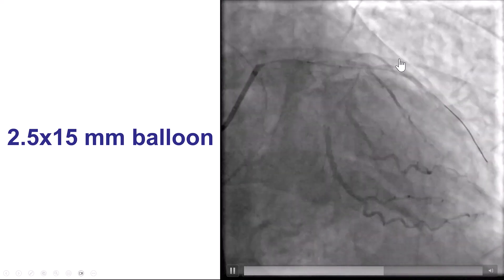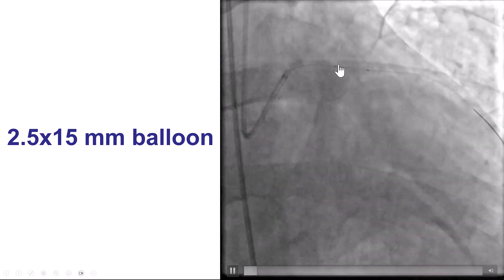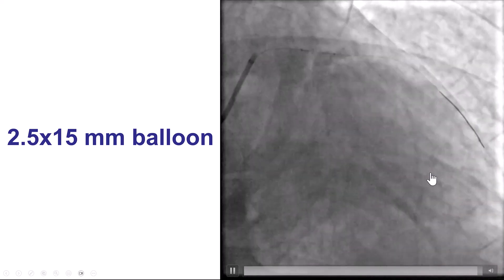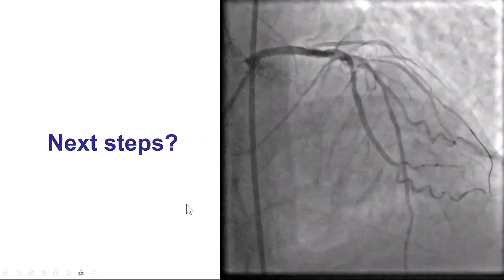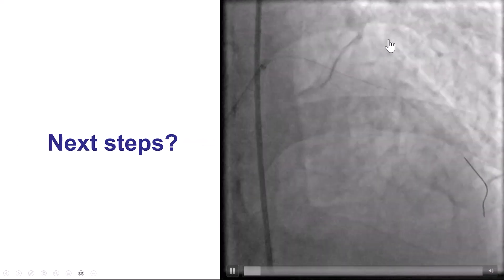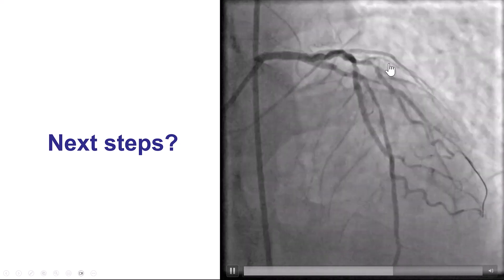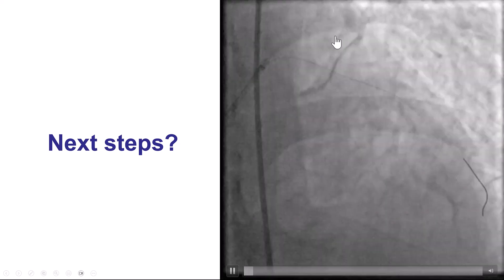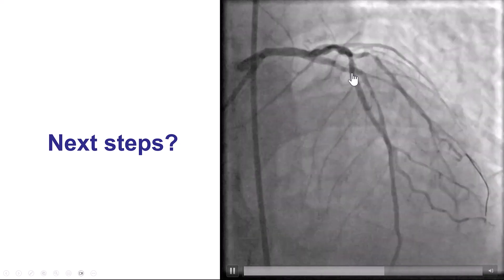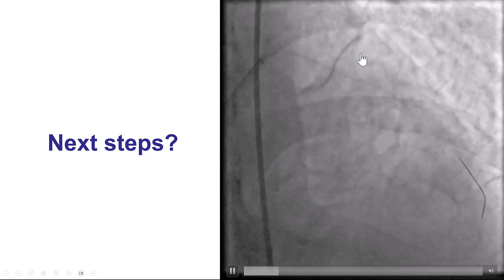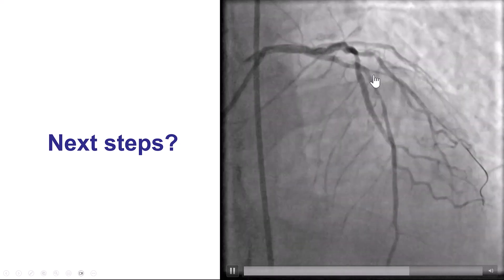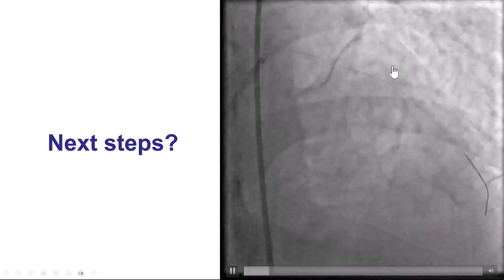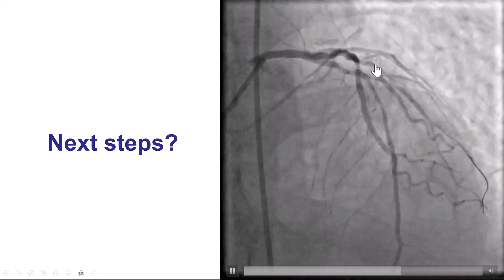We now have antegrade flow. The wire is actually in the large diagonal branch. There is some thrombus, and there is now TIMI 2 flow into the LAD. The problem is that this is a bifurcation lesion — there is significant disease in the ostium of the diagonal branch, which is fairly large, and there is disease in the LAD both in the proximal as well as the mid. This is a case of a bifurcation lesion in which we have a large side branch that needs to be preserved, and the risk of occlusion is high given the significant ostial stenosis.